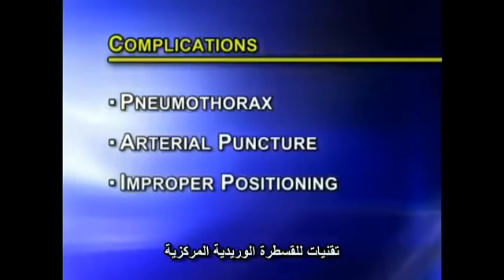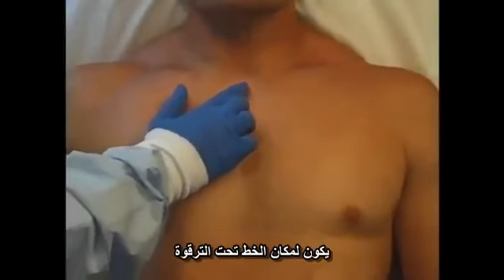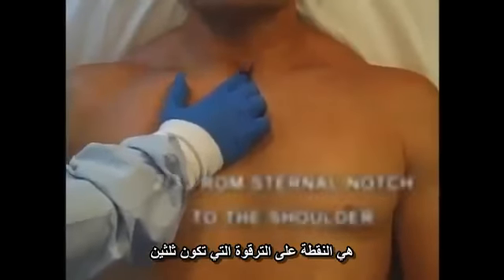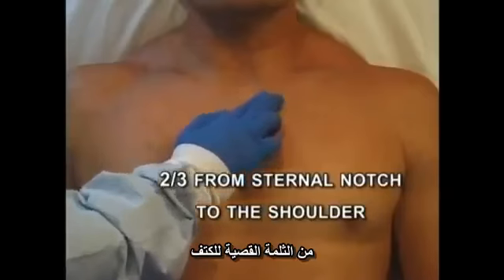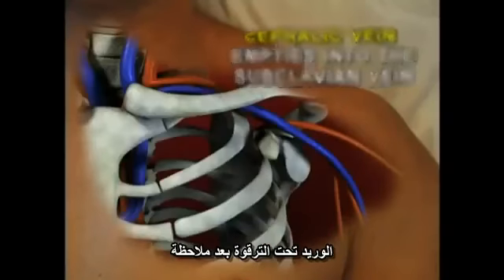We will describe the technique for subclavian central venous catheter placement. The landmarks for subclavian line placement are the point on the clavicle that is 2/3 from the sternal notch to the shoulder. This area may also be noted by finding the deltopectoral groove in between the pectoralis major and the deltoid muscles. It is in this groove that the cephalic vein runs and empties into the subclavian vein.